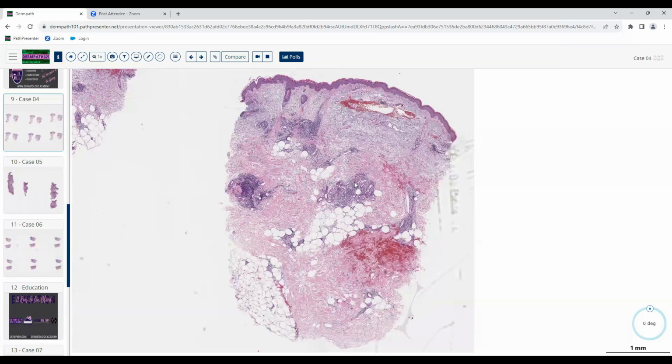They look mostly like lymphocytes. Yes. If they look dark and black at low power, they're going to be lymphocytes. Now, we may go to higher magnification. There may be some EOs. There may be some plasma cells, something like that. But at least at low power, we're going to say this is a superficial and deep lymphocytic infiltrate.